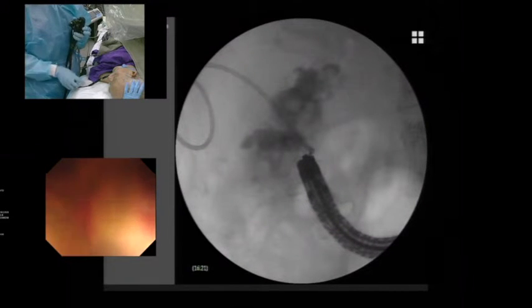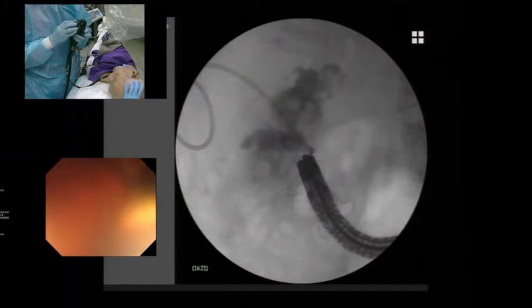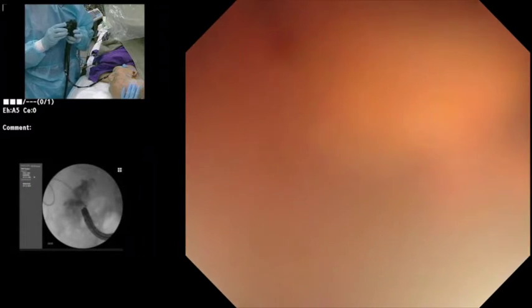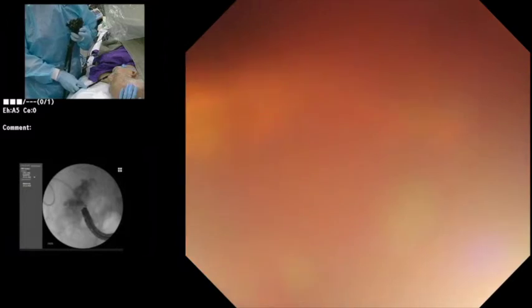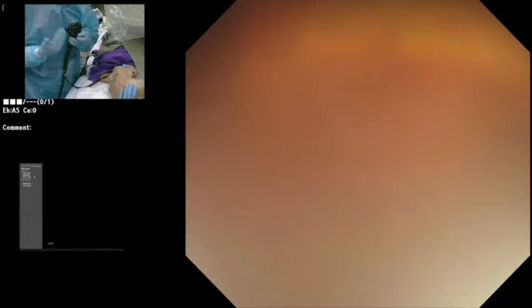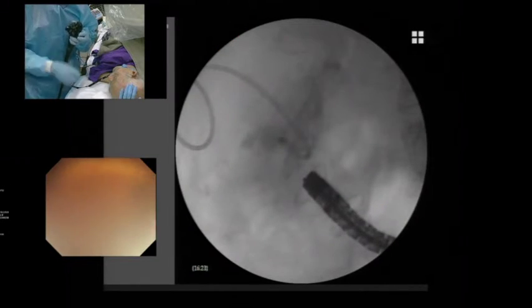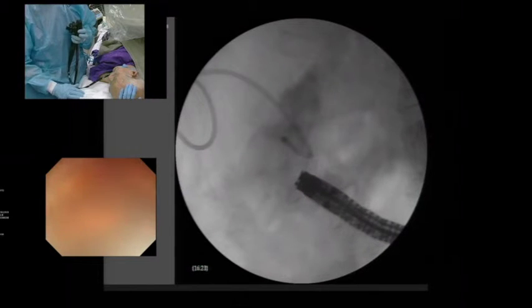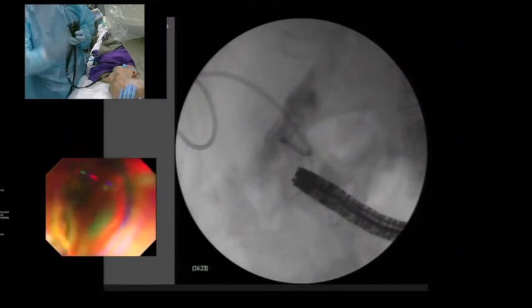One of the studies that we're starting is investigating the advantage of placing, in this type of infected cavity, a nasocystic catheter, whether it has benefit over drainage alone. That remains to be seen because we have such a large opening of 15 millimeters. Perhaps that's sufficient. If you just go in weekly, and it may require no more than 2 or 3 sessions, and debride out the cavity, again, it's a 5-minute procedure because you can go through the stent as a port, so you have easy access. You don't have to redilate.